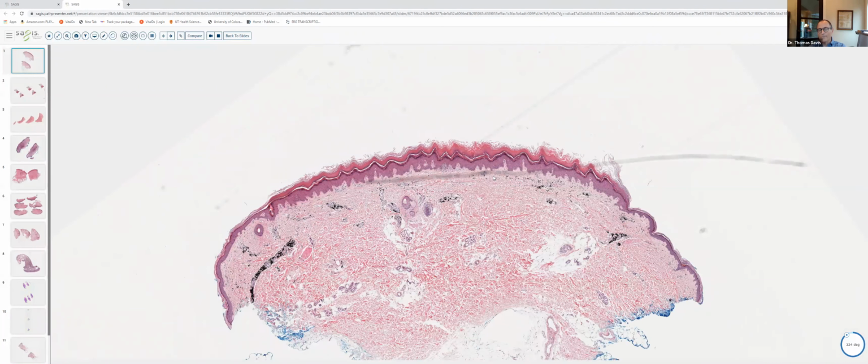And this appearance with these microspherules surrounded by granulomatous inflammation is very characteristic of calcium hydroxylapatite or Radiesse. It's non-birefringent, and in this particular instance, the material was injected into the nasolabial fold, and Radiesse will occasionally migrate, and it migrated into the mucosal surface of the lip, and the patient had a nodule there.